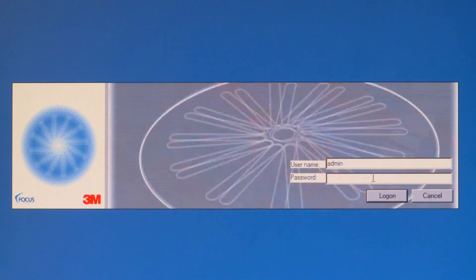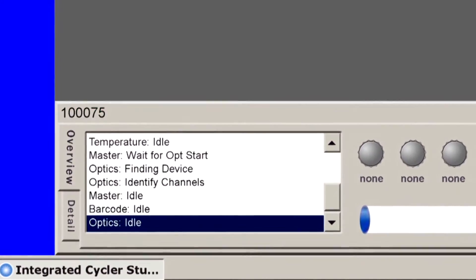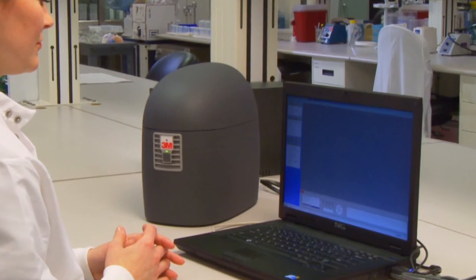Open the Integrated Cycler Studio software and log on. The software automatically runs a fast, thorough firmware inspection and the instrument is ready.